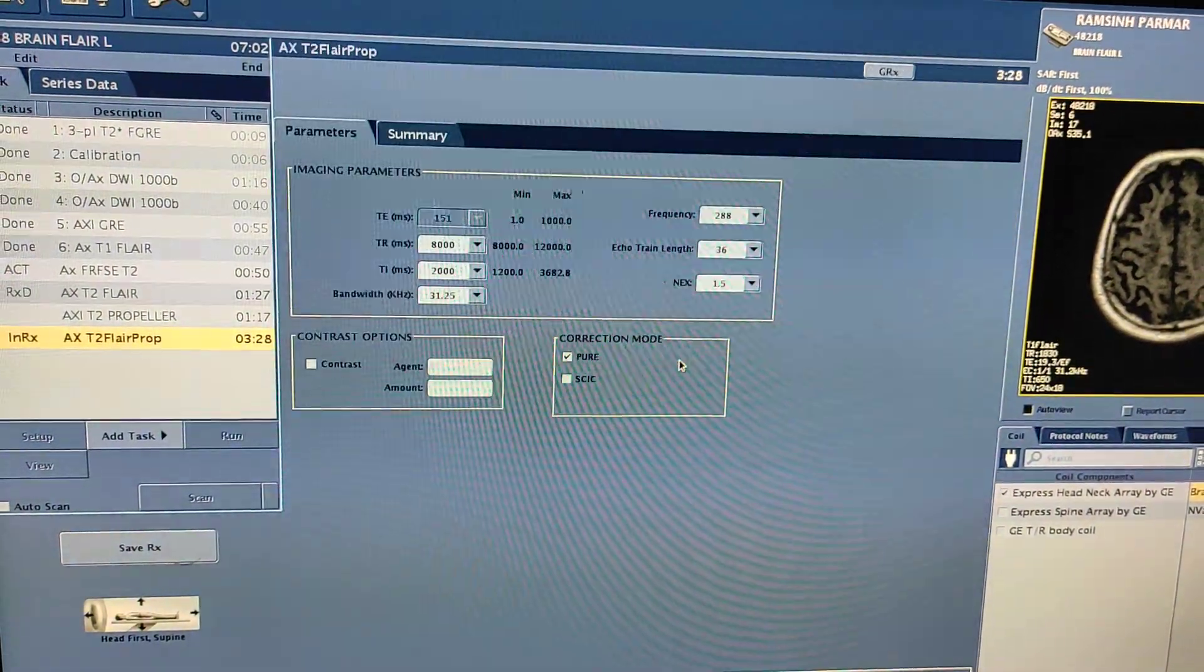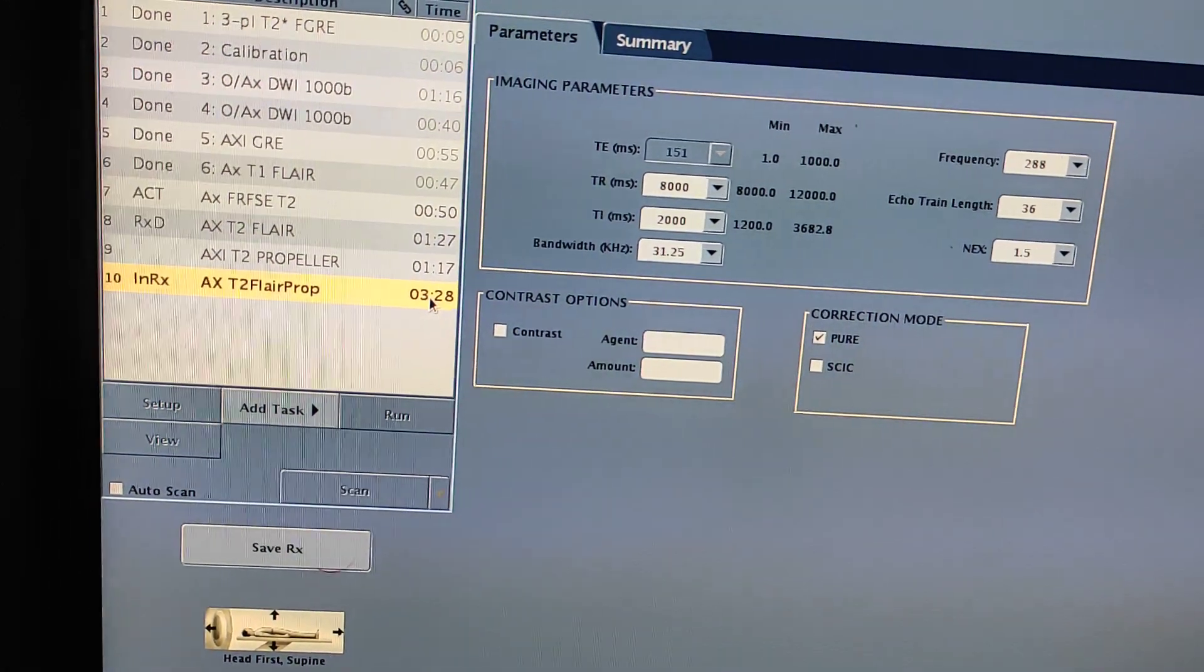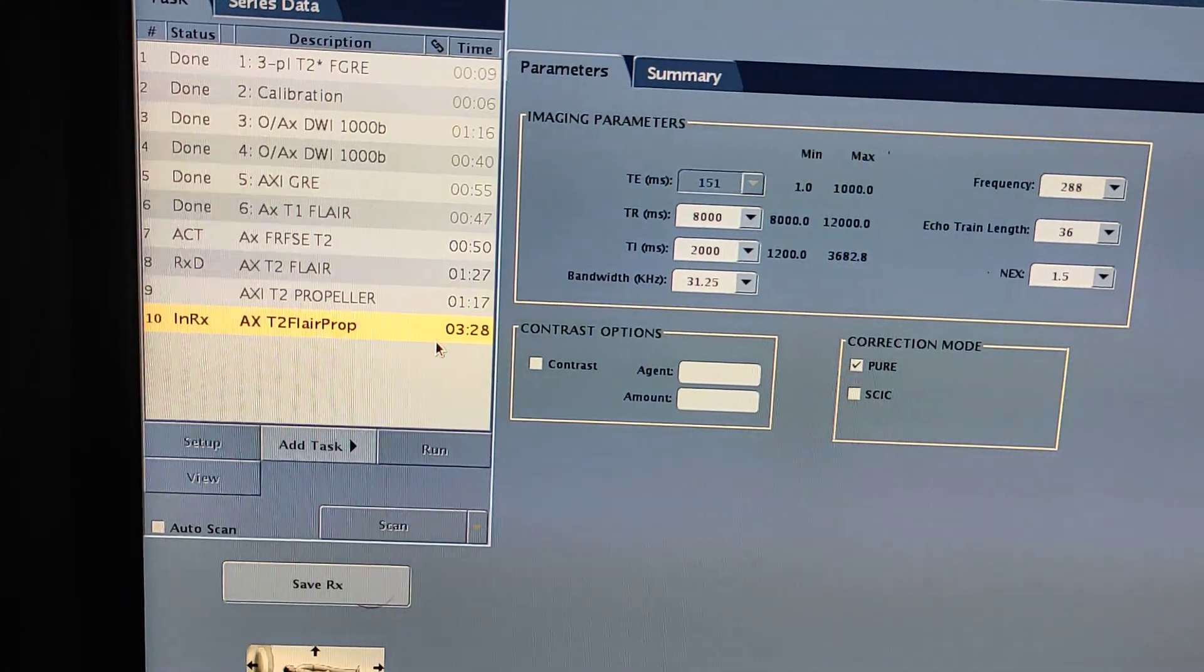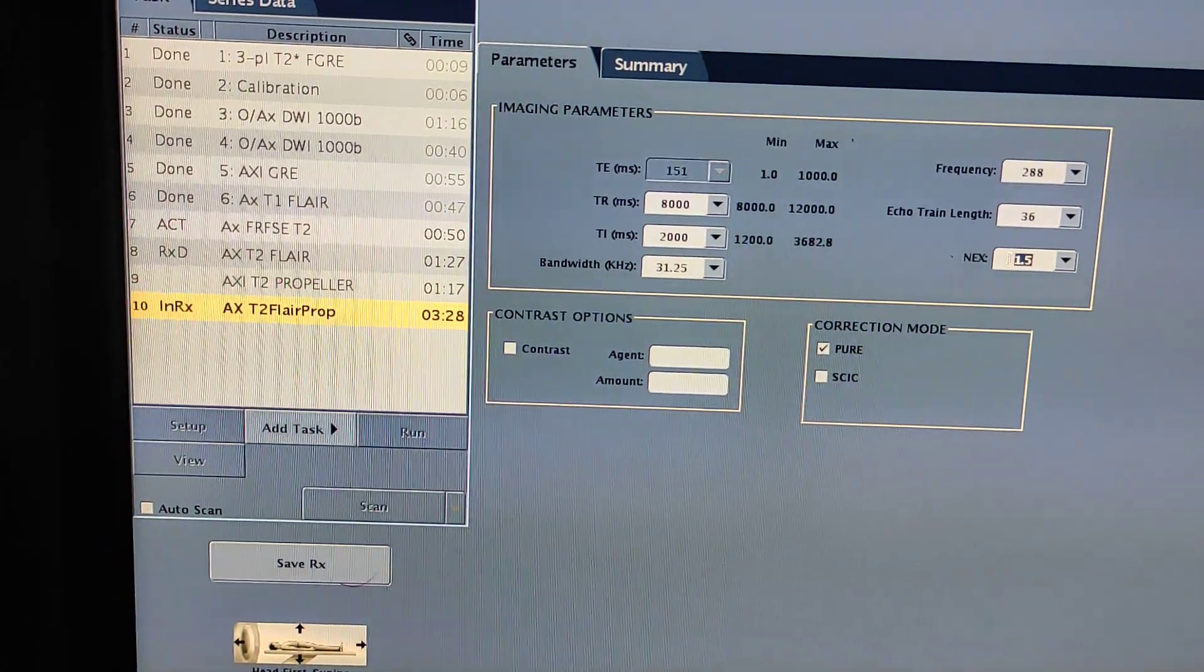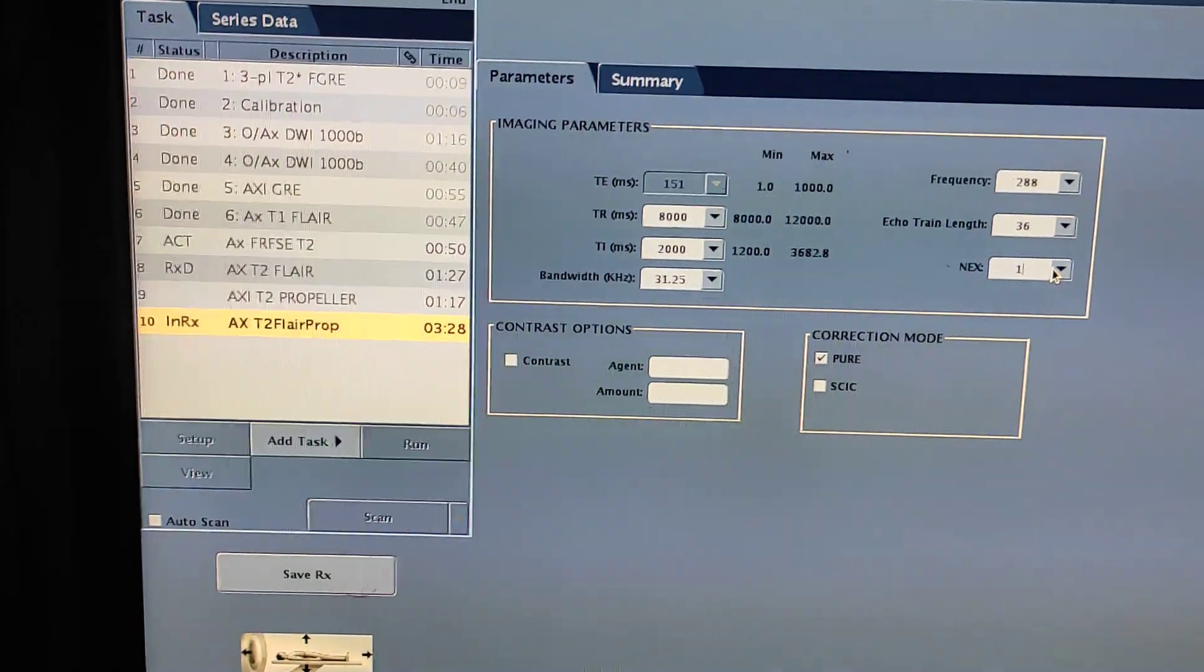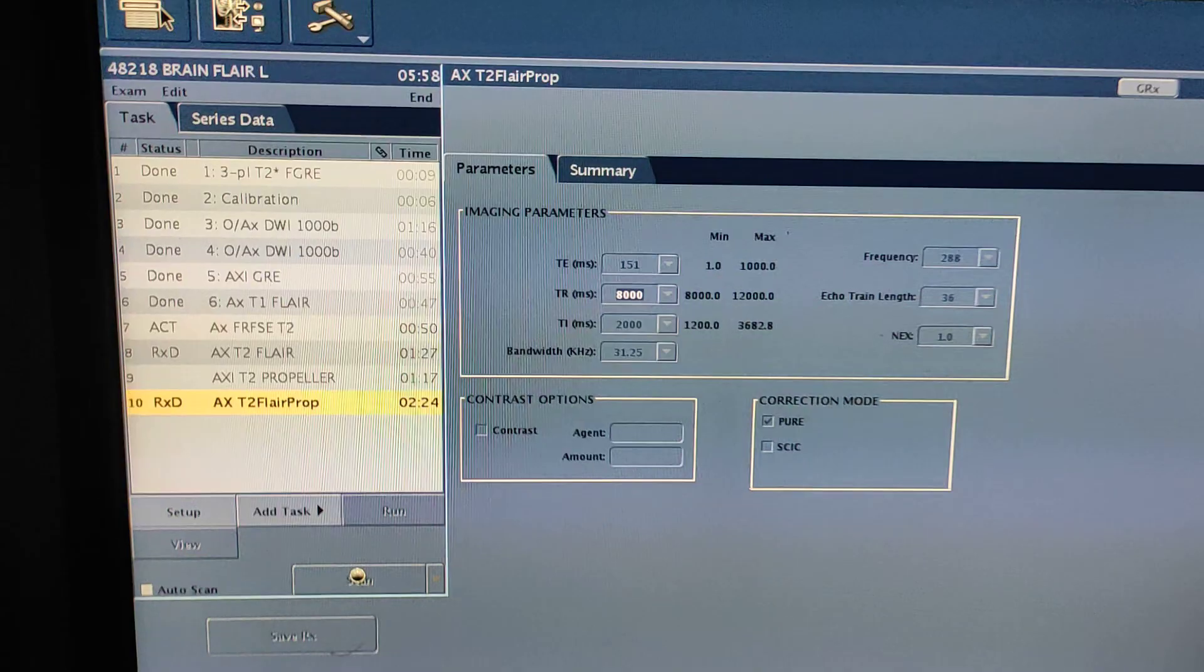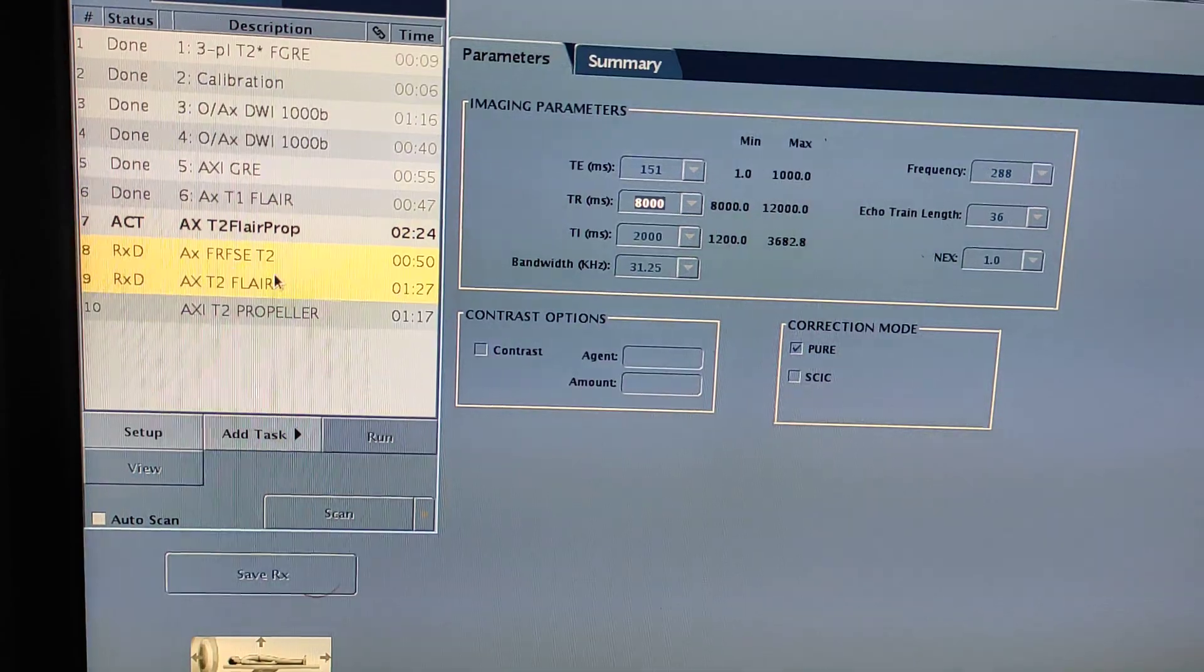This is the interface for the propeller. This is a motion correction sequence. It will take more time than a routine sequence to give a proper good quality image. If the patient is giving motions when scan is going on, this sequence will still give you a proper diagnostic image with motion correction. Now I'm scanning axial T2 FLAIR propeller sequence.